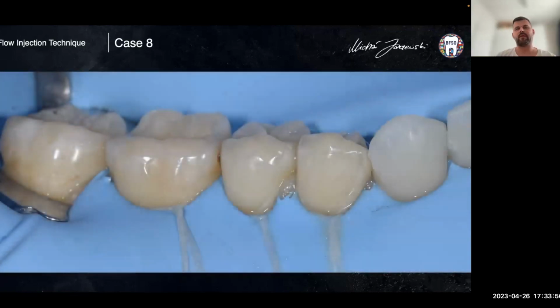So this was a part of general dentistry. But when you want to restore all teeth, for example also from the buccal area, we need to add some rubber dam and also some dental floss to move the rubber dam into place and move the gums a little bit.